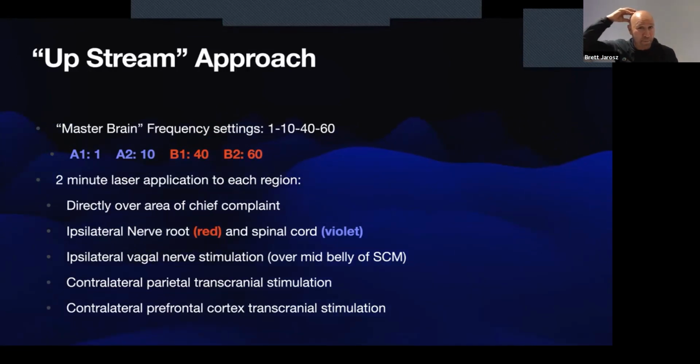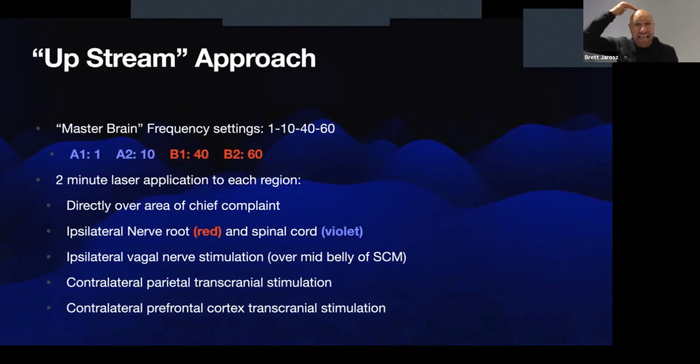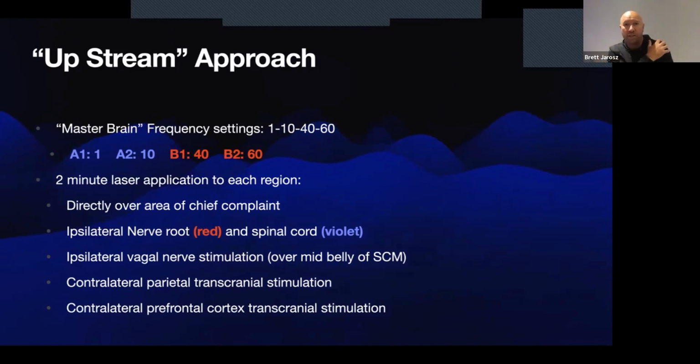Parietal cortex, of course, that's where the mapping of our body parts is. We know that people who have pain, especially chronic pain, get remapping of their brains. Cortical smudging is one of the terms you'll hear in the literature. So lasering the brain to correspond to the area. We want to understand that. We want to understand our homunculus. So our shoulder is going to be out here on the side, arm, face, hand, etc. The upper body is out here on the side of the brain, versus when you get to the lower back, the hip and leg, that's happening in the midline here, that sagittal area. So depending on the area we're talking about, the example we're going to use is the shoulder.